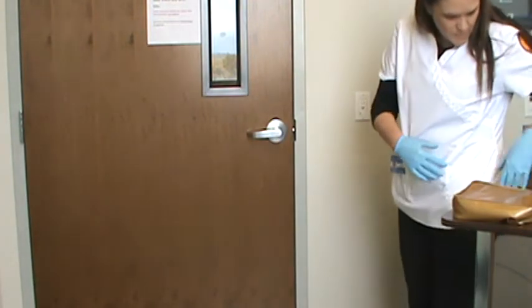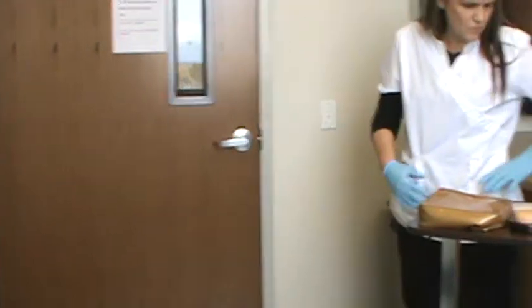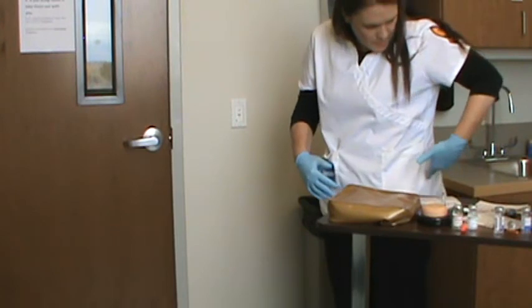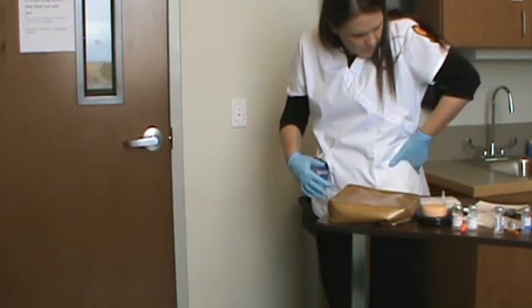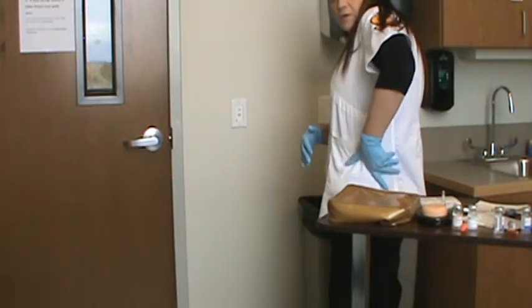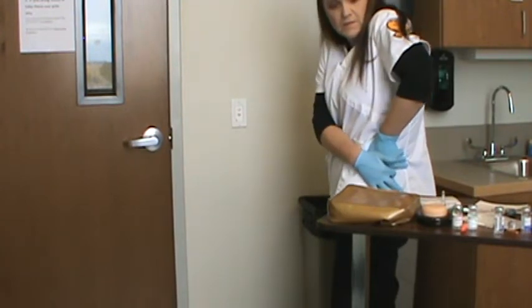And then the last one, your dorsal gluteal: your thumb needs to be towards your pelvis, and then your hand right here, your fingers towards your iliac crest, and then your shot goes in right there.